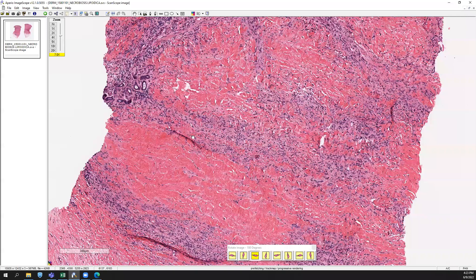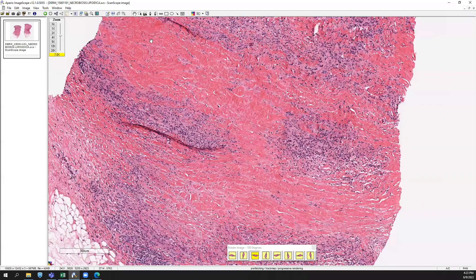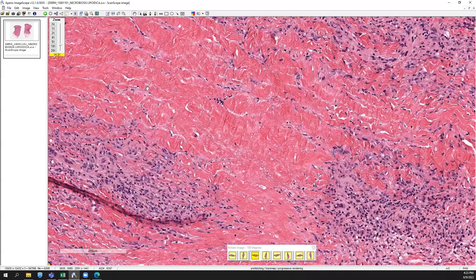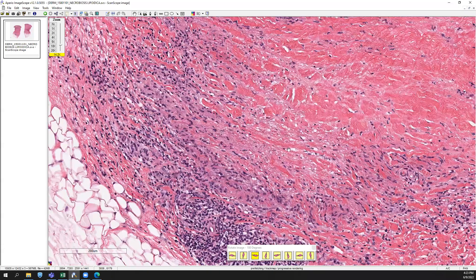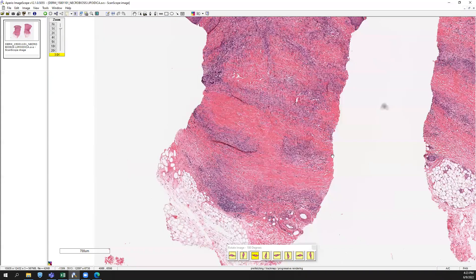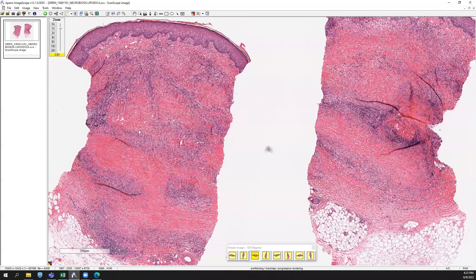You can see it's kind of horizontally distributed, separated by this necrobiotic collagen or smudgy collagen, which is undergoing some type of degenerative change. So with this degenerative change of the collagen with the parallel bands of lymphohistiocytic inflammation that looks like a cake layer, the top diagnosis you should be considering is necrobiosis lipoidica.